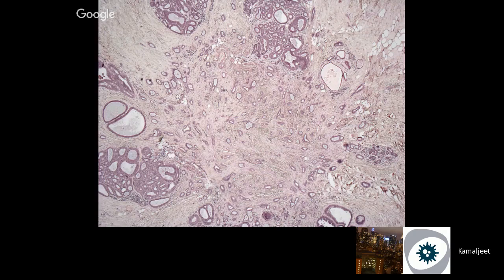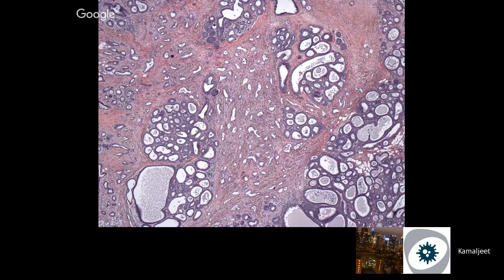This is an image from a typical tubular carcinoma. So what makes tubular carcinoma? Tubular carcinoma is, again, a combination of findings, which includes the architecture of the glands as well as the stroma. You can have more than 90% tubules in a grade 1 invasive ductal carcinoma, and that won't make it a tubular carcinoma. What makes it tubular is these angulated open glands with this evenly cellular desmoplastic stroma. If you compare this stroma with the stroma outside the tumor, it's very cellular.